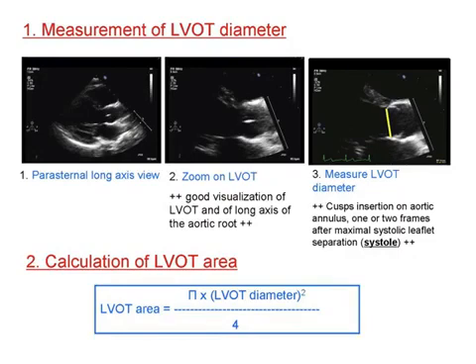So to measure the cardiac output, the first thing you do is you measure the diameter of the left ventricular outflow tract. And you can see that in the parasternal long axis. So first thing you do is you go back to parasternal long. Remember that? That's the RV up here, the LV over here, the LA is here, mitral valve is right here, and then the blood comes in this LV, and it gets pumped out this aortic outflow tract.